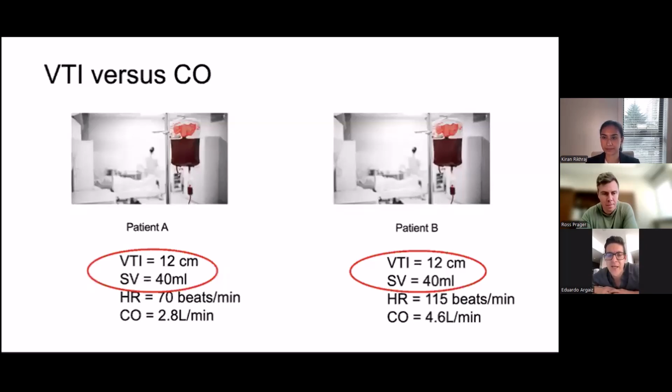Because there's a high cardiac index. And if your minute VTI is like 500 or 400, then that's a very low cardiac index. And I think it's a very helpful tool. I use it all the time.